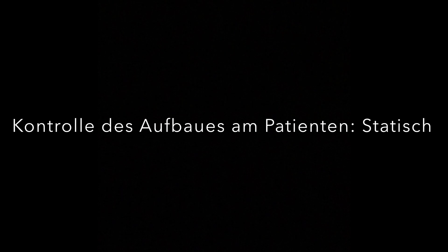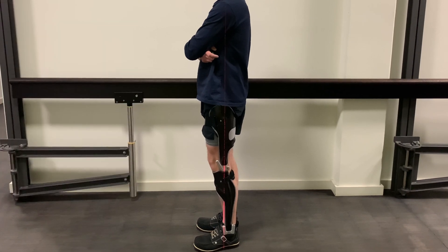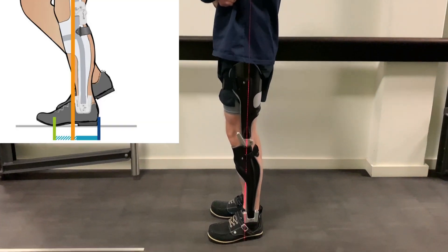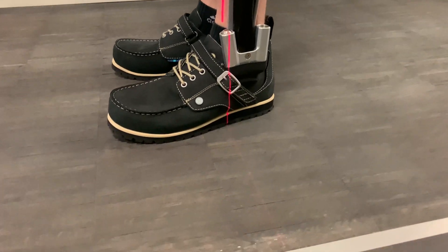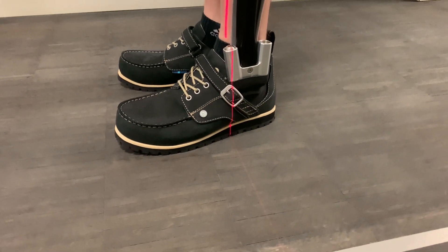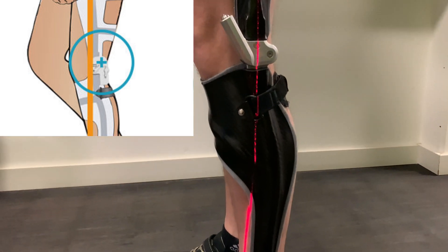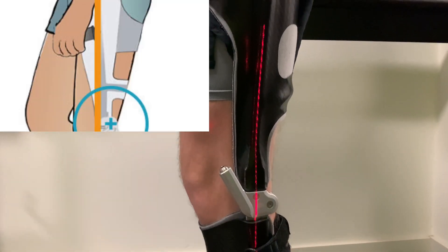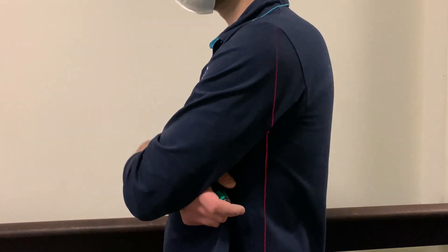Kontrolle des Aufbaus am Patienten statisch: Wir beprüfen, ob der in der Grafik dargestellte statische Aufbau für den Patienten umsetzbar ist. Beginnen wir am Fuß – fällt das Lot durch das hintere Drittel der vorderen Hälfte der Unterstützungsfläche? Und fällt das Lot durch die Mitte des AP-Maßes, durch die Mitte des Oberschenkels und durch das Körperzentrum?